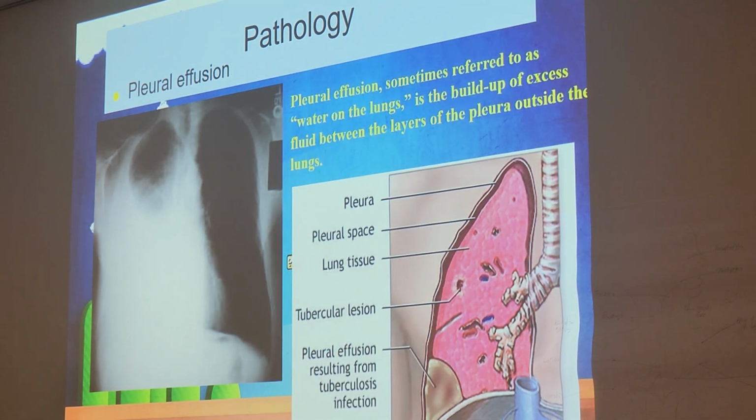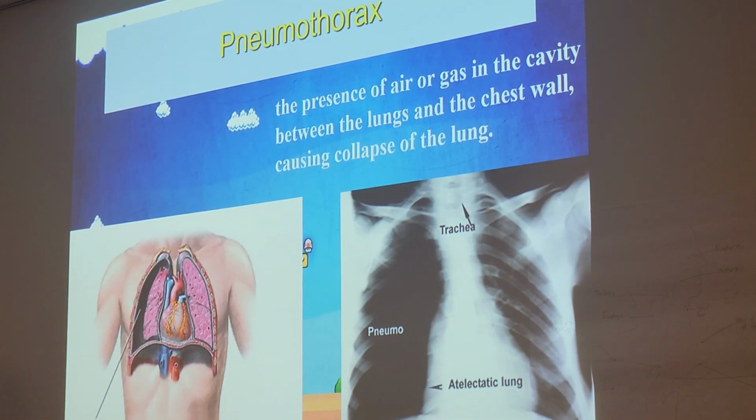So what is this machine that you're talking about? Chest tube machine. I'm sure you've all seen that by now when you're going to the rooms with portables. They're on the floor. They're like a rectangle, like a box. You see the fluid going in there, tubes. So you want to hit the one with the machine? Please don't do that. You might rip the tube out of their chest. That's very painful, as you can imagine.